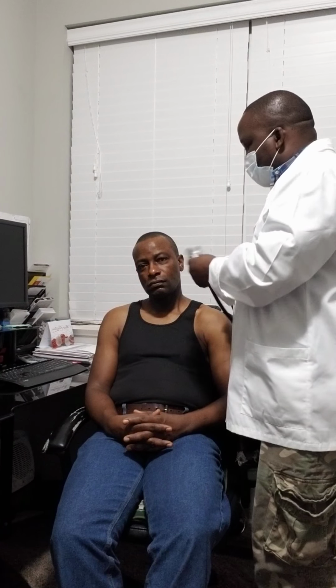Okay, and then you also do the same thing on the other side of the carotid artery. You also listen on the other side using the bell and the diaphragm of the stethoscope. The palpation also should be done on both sides, but you have to do one side at a time.